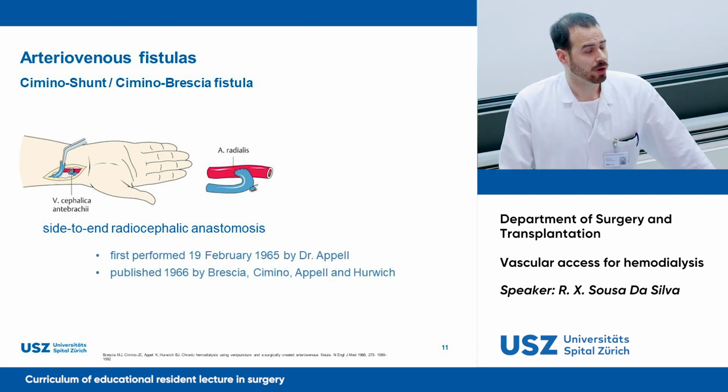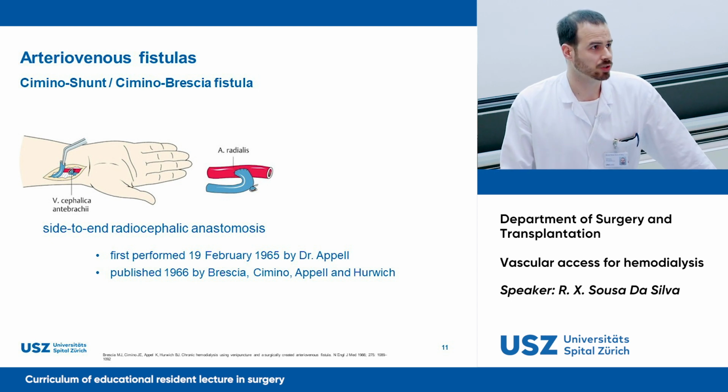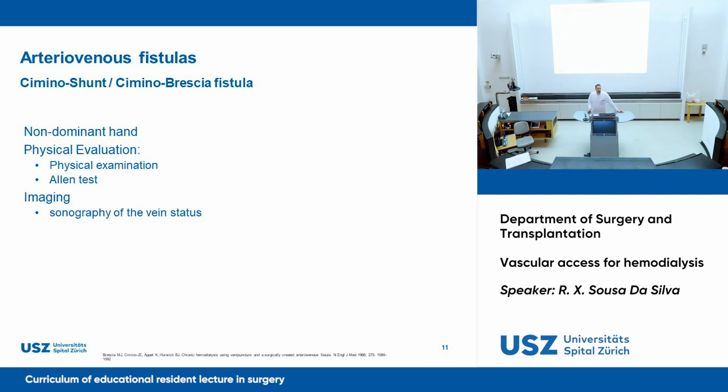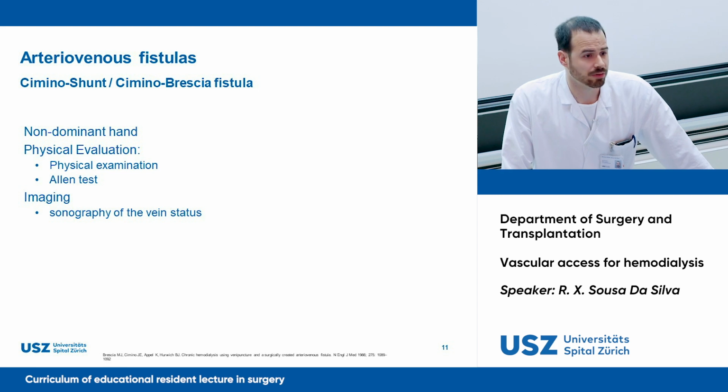Exactly. It was first performed on 19 February 1965 by Dr. Appel and published a year later by Brescia, Cimino, Appel himself and Hurwitz. It is performed, if possible, in the non-dominant hand, especially because during dialysis patients wouldn't be able to use their dominant hand for 4 hours. That's the main reason. And it needs a physical evaluation beforehand.